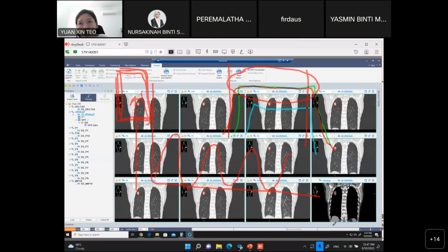And then currently in all treatment centers we use IGRT, which means image guided radiation therapy. What we perform is a CBCT to see whether your position is correct or not, then only you deliver the beam to the patients. Then now with this 4D gating, we also have another thing called SGRT, surface guided radiation therapy.